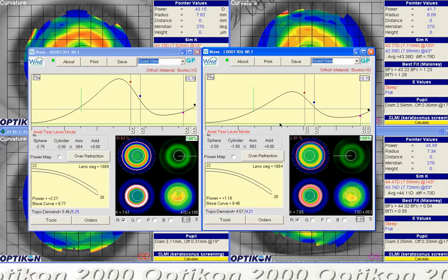Okay, so the post-wear refraction for the left eye was minus 75, minus 1. So as a whole, I would bump this 75, so that'll put us around 1.93. This is going to be in 100% mode.